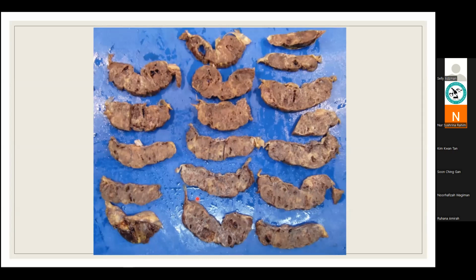Be aware, sometimes you can see this lesion at the side, which is normally seen in term placenta, because the fibrin gets deposited further away, as this part is not best supplied. So sometimes part of the villi are degenerated and surrounded by fibrin, usually at the sides.